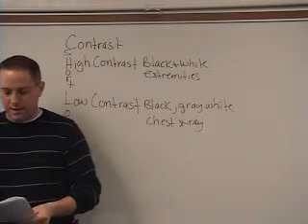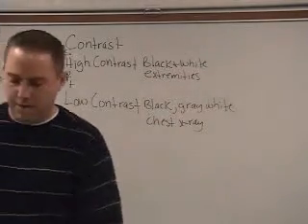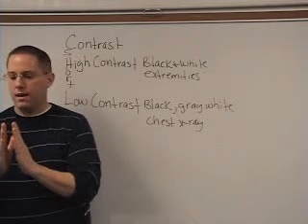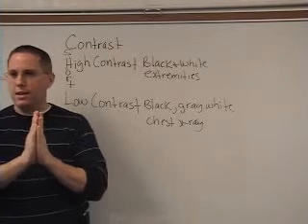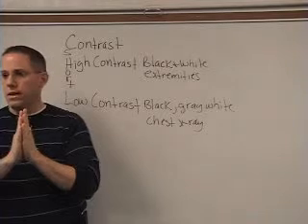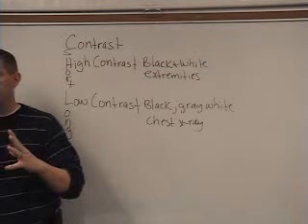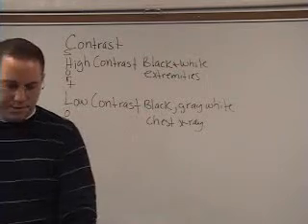They actually call it the OFD, the object to film distance. That's on the bottom of page 5. The object to film distance is that small distance between the x-ray cassette and the body. That's why when someone does a chest x-ray, you have them stand right up against the bucky that's on the wall. If they're standing like 5 or 6 inches away from it, that means they're getting closer to the x-ray tube, so that's going to make everything look bigger. So you got to get it right against the x-ray cassette.